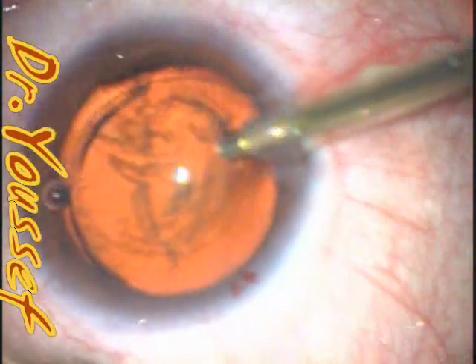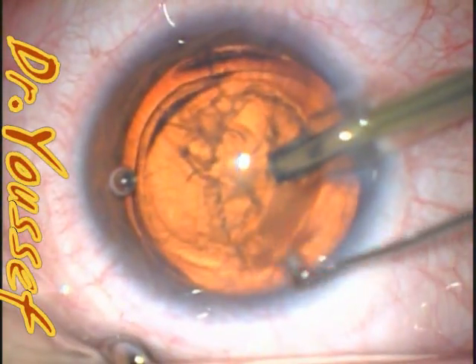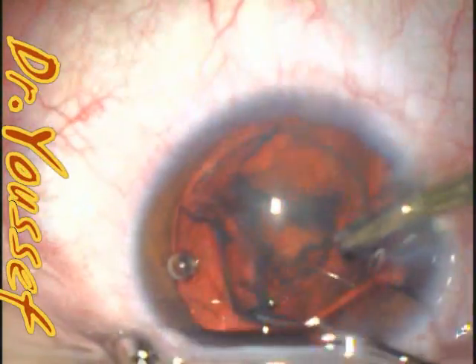Those lenses may need to be repositioned or explanted. The best outcome is for it to be discovered early enough so that repositioning is easier, before the capsule fibroses.